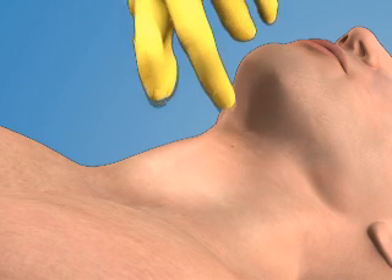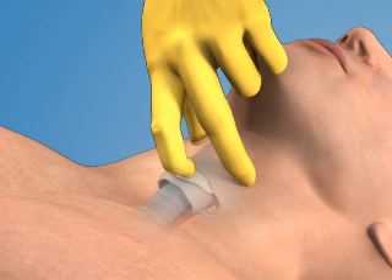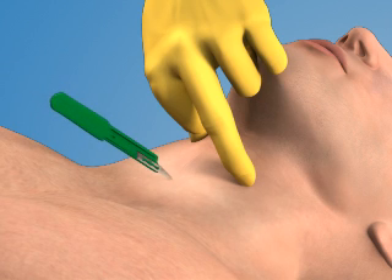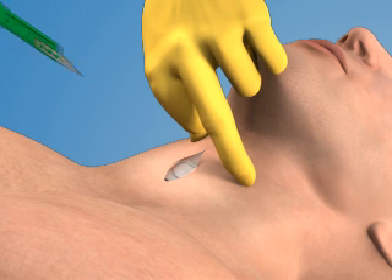Stabilize the larynx with your non-dominant hand by grasping the sides of the thyroid cartilage with your thumb and middle finger. Use your index finger to palpate the depression over the cricothyroid membrane. Use the 11-blade scalpel to make a 2-3 cm vertical incision through the skin and subcutaneous tissue overlying the cricothyroid membrane.